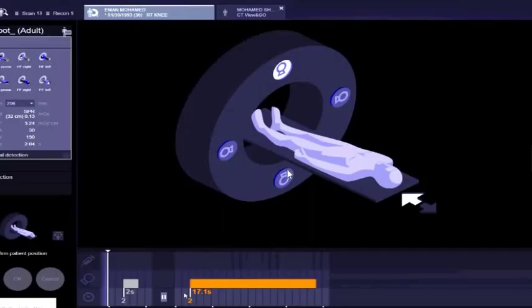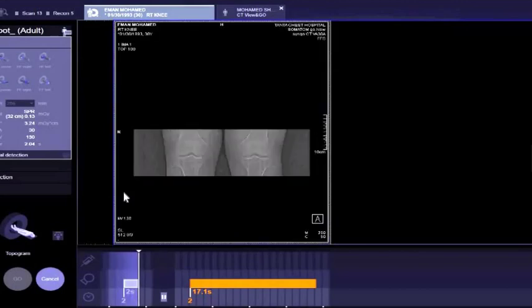This is the page of the examination or the scan. There is the position of my patient. The patient is supine and feet first. This light in the top means that the scout or the topogram will be anterior-posterior. The position of the topogram will be anterior-posterior. Okay, after that I will give the CT order to start my scan. Okay, press start. After that the CT will take my scout by this shape.